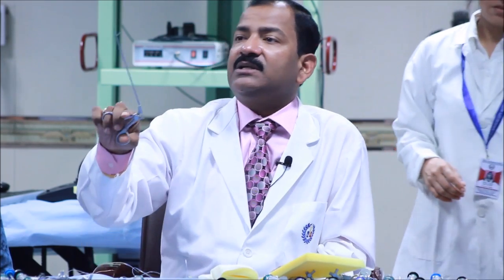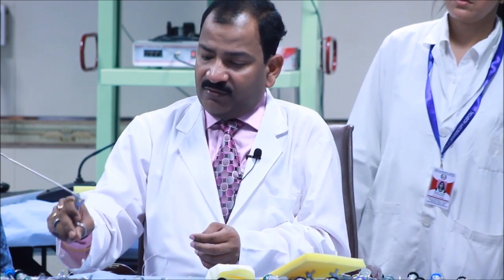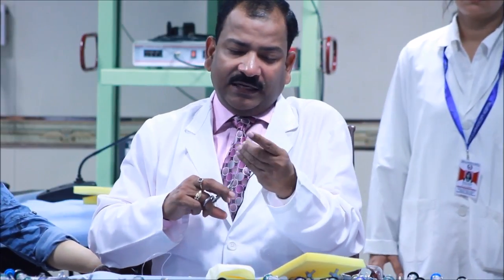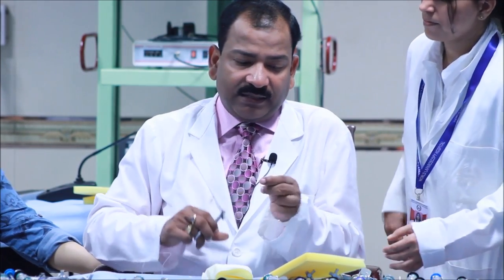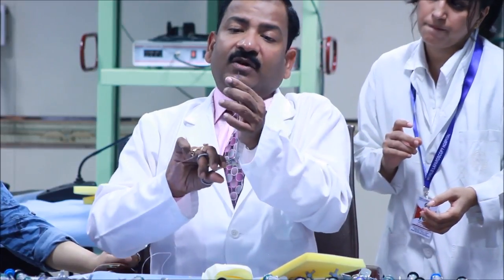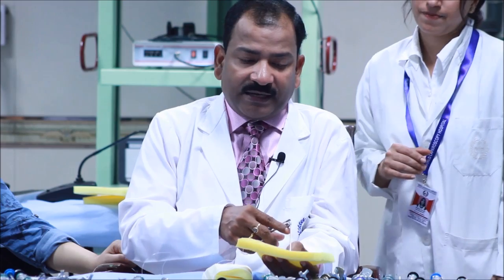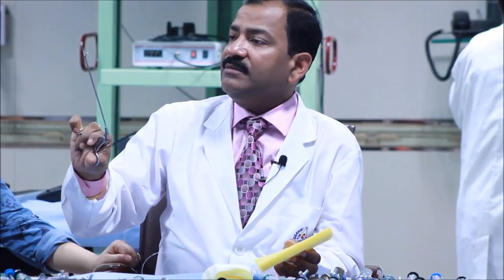Suture passer, there is one small eye. Can you see that? But there is a problem. Sometimes when you are holding this suture in this small eye, and if accidentally you hold it by the base here like that, then it remains open. Can you see that? Here, if you hold like this, this is open, even when I am not holding it open. And then if you try to go, it will break because it is entangled into the tissue. So this is a risky instrument which sometimes is dangerous.